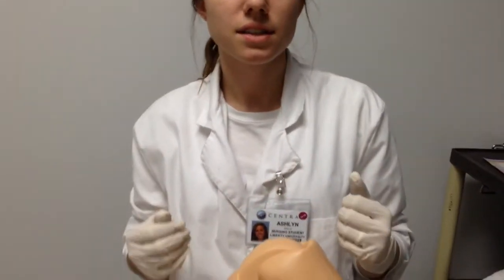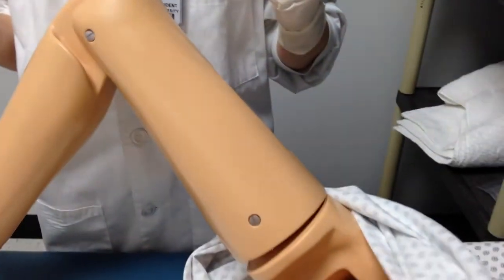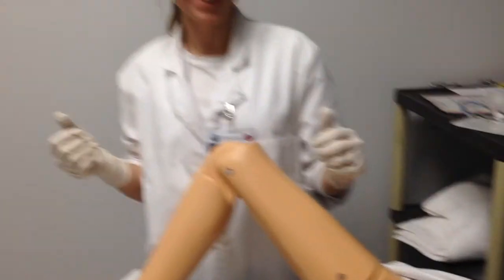And how will you secure the Foley? You mean how I secure it? Just in a male, you pull up the penis and you just tape the tube of the Foley upward just so it doesn't tug out. Okay. That's okay. You did everything else perfect, so great job. Thanks.